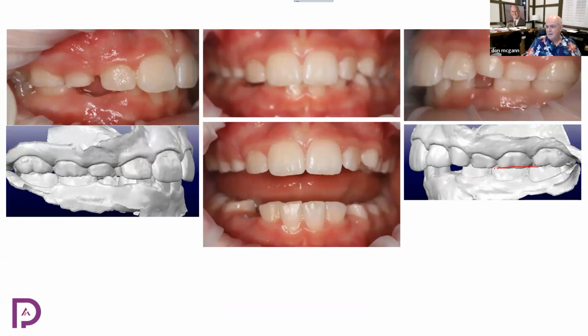If I make a line, as I mentioned, maybe we could intrude the upper incisor a couple millimeters, the central incisor. So on this one, you just say level, upper, and lower, okay? And endpoint overjet overbite is going to be what? 2 millimeters, okay? Now, if you want, you could say 1 millimeter, but I don't think you're going to see the difference at 1 millimeter.